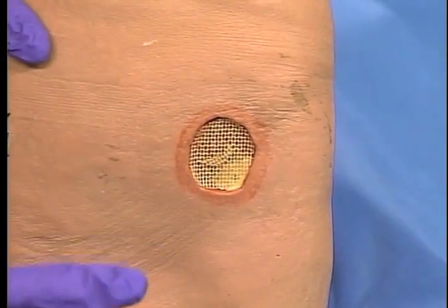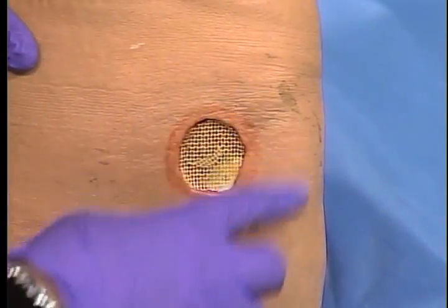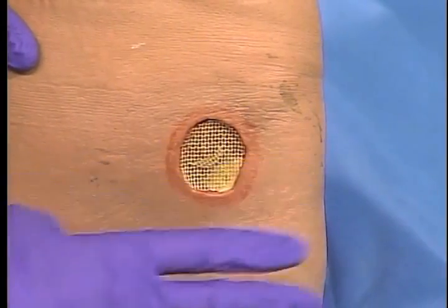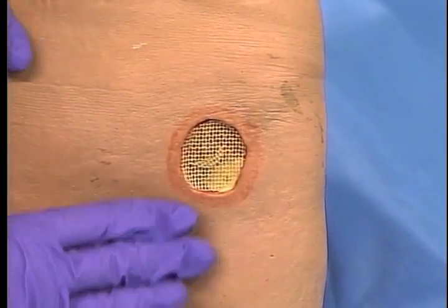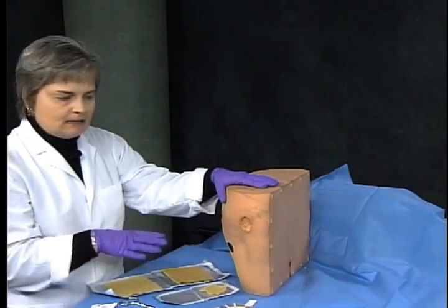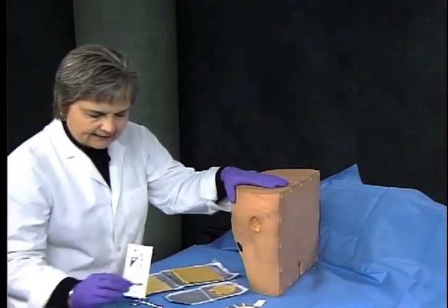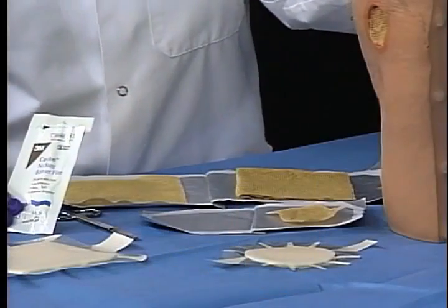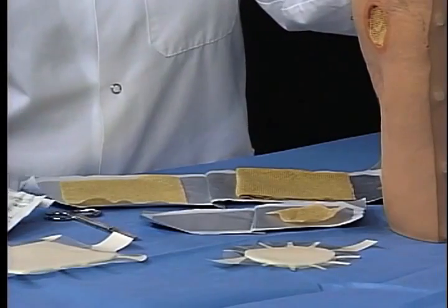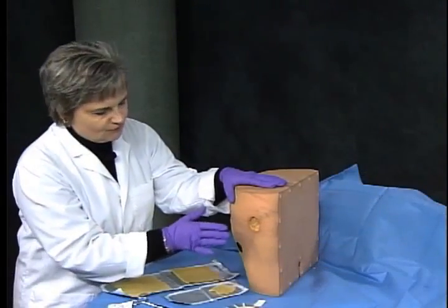And that's important because the dressing is moist, or will become moist as it absorbs drainage. You don't want the surrounding wound edges or surrounding skin to become macerated. Now, if the wound has quite a bit of drainage, which is not uncommon for wounds where you're using a silver dressing, you may want to go ahead and use an alcohol-free barrier film to paint the wound edges in order to provide additional protection from moisture.